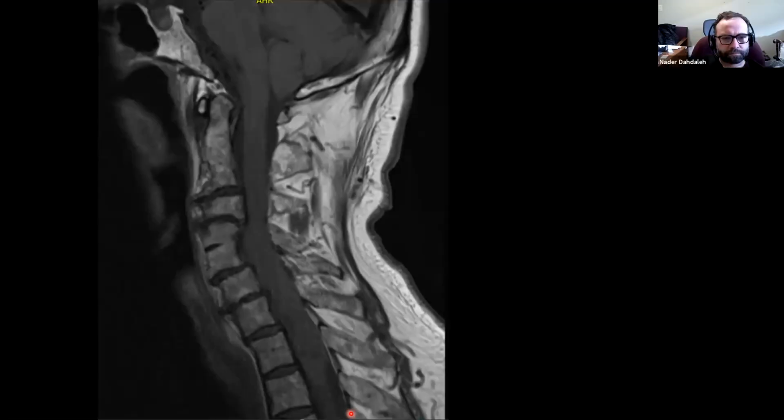Okay. So I can show you now the MRI. This is a T1. Wendy, can you as a neuroradiologist say, is T1 useful in trauma in these questions in spinal cord imaging? I mean, you can see that there's something abnormal going on. You don't have any CSF space, which is blacker than the cord, both at the level of compression, which was C4, and below that. Yeah. But you won't be able to see the edema well. This is the last view I will show you.